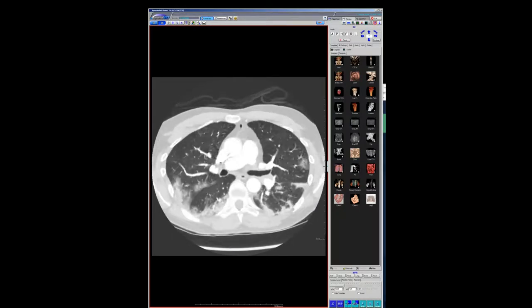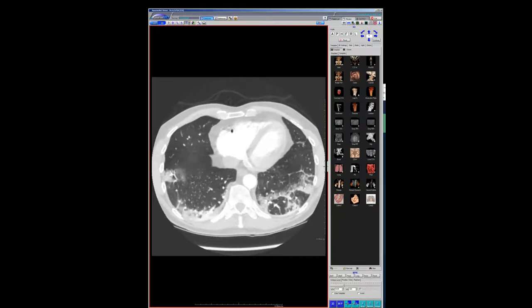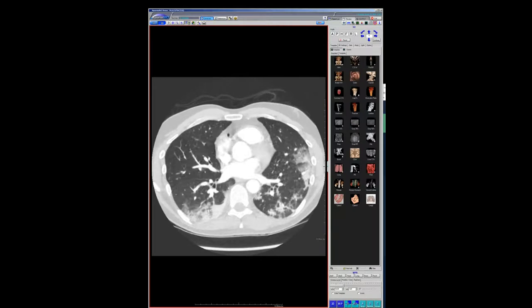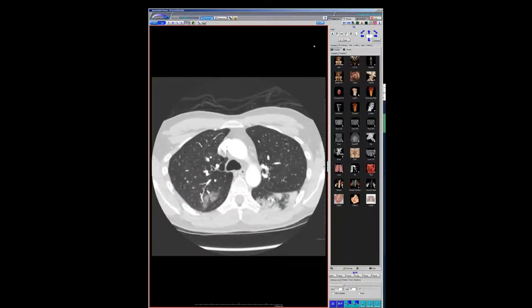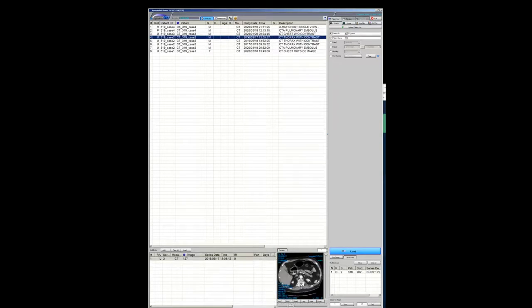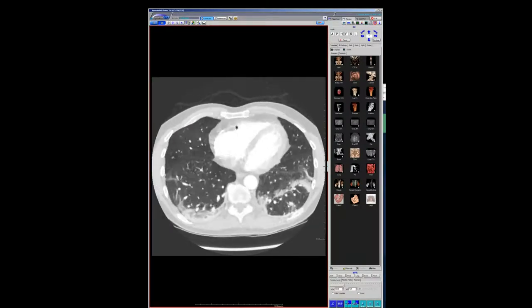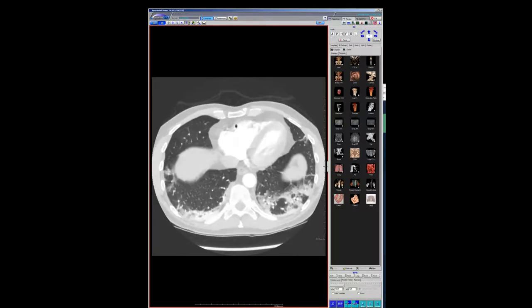It's organizing pneumonia. It's probably from COVID. But the question is, what terminology do people want to start using? It's interesting. The airline pilot had been flying back and forth to Germany when this was all starting to break out, and who knows how many people got exposed along the way. So I think this is almost certainly COVID. The reason I don't think it's another viral pneumonia is because most viral pneumonias, except for COVID, have mostly upper lung ground glass abnormalities. And COVID likes mid lungs and bases in a lot of the cases.